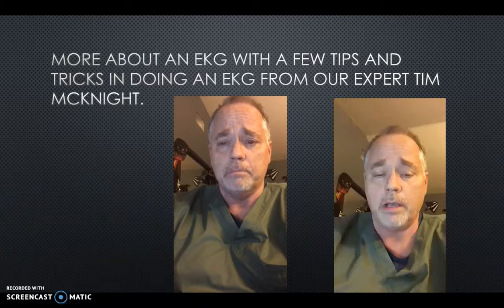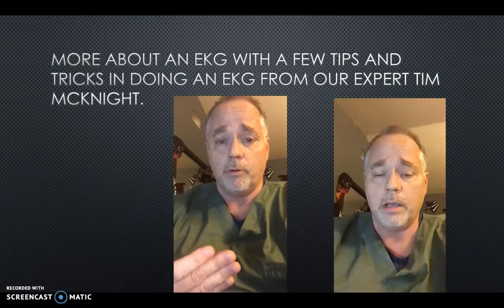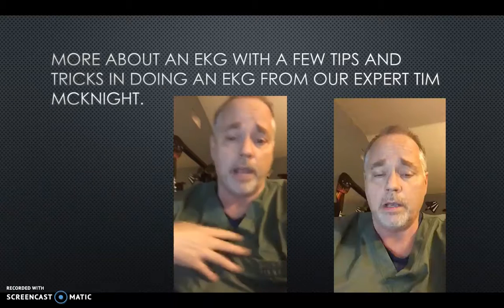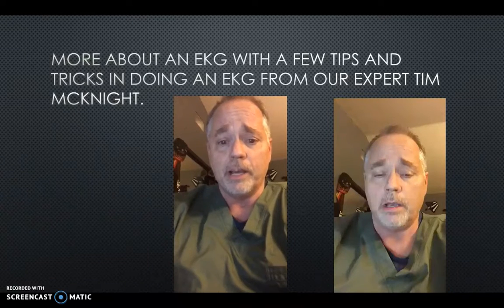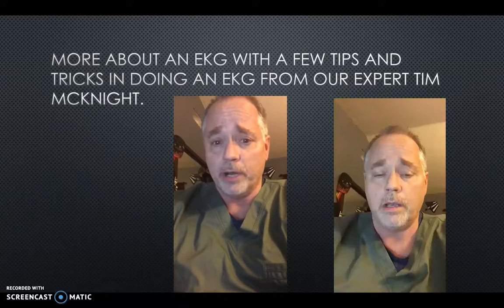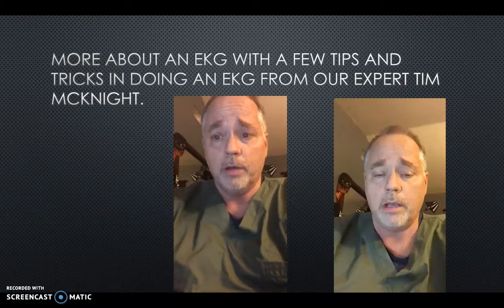A few of the other important things is you need to have areas on the chest that are relatively dry and really free of hair, which requires shaving if it's a male with an exceptionally hairy chest. A lot of adult EKGs include some type of process with a razor. It is no fun. I had it done once. Anyway, you would have to shave the area to apply the EKG leads, and explain to your patient what you're going to do there as well.